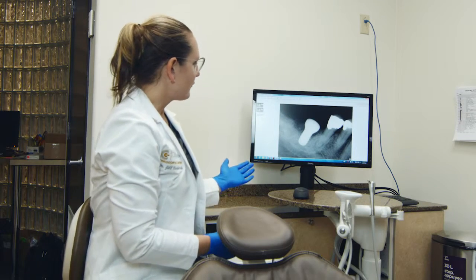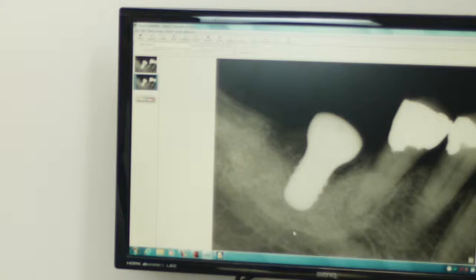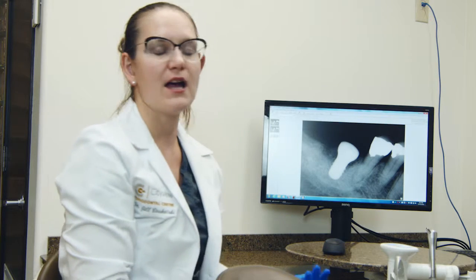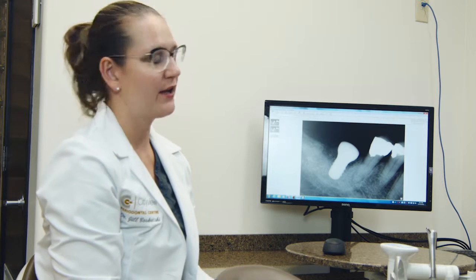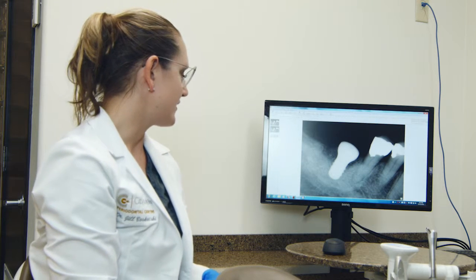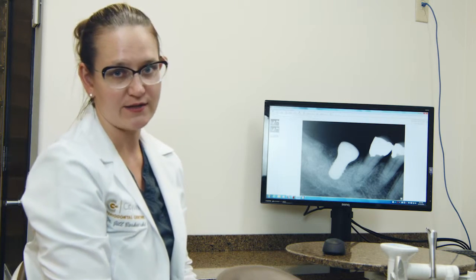And so here is the final radiograph of this patient, and the inferior alveolar nerve pictured here is far away from the planned implant. You can appreciate that the implant placed is parallel to the adjacent tooth and will allow for a proper emergence profile restoratively. And this case took less time than I would normally take to place an implant, but it is, in my opinion, extremely accurate and well positioned. And so it was a very, very simple procedure to use the system and to get very good results and outcomes, in addition to improving my efficiency and patient safety.